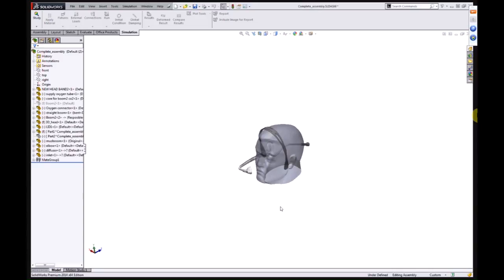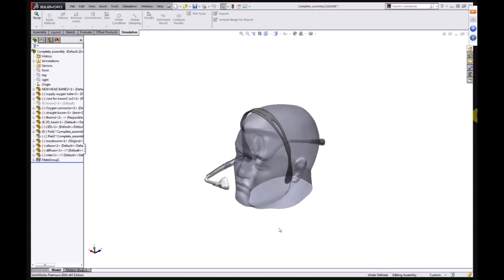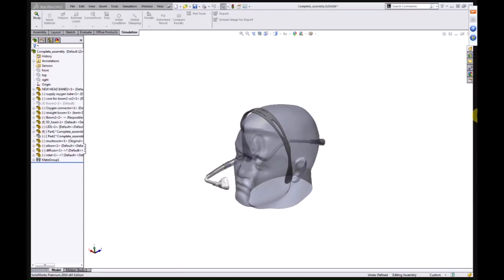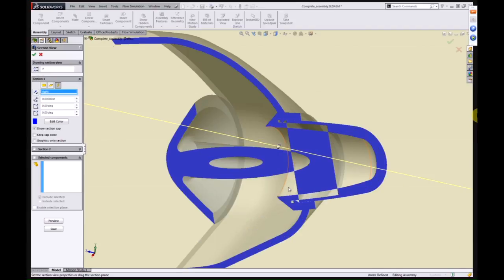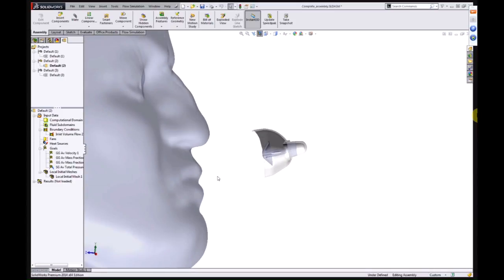So what we need to know as an analyst here is what oxygen concentration the patient is seeing, and how can we adjust the design of the little vessel here to optimize what the patient sees? We've got a baffle here and a diffuser to disperse and spread the flow accordingly. We could also investigate how different positions of this little arm, the arm is obviously adjustable, affect the therapy the patient receives.